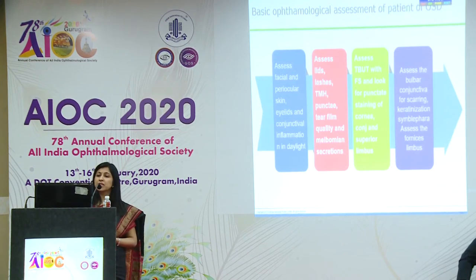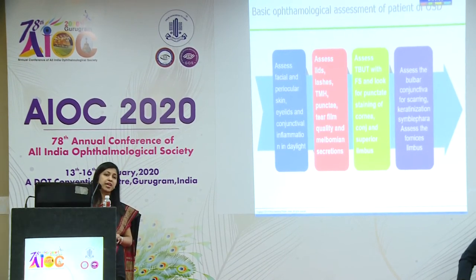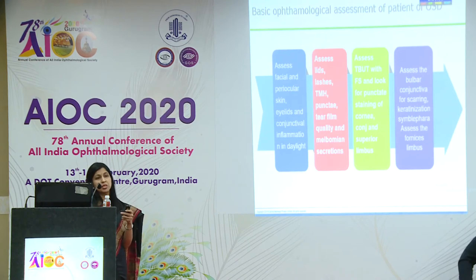So we have to understand what is the basic ophthalmological assessment, and it includes a proper assessment of the facial skin, the periocular skin. So you start doing a broad daylight exam without doing a slit lamp first, then go on to the slit lamp examination looking for every part: the lids, the lashes, the punctae, look at the meibomian secretions, the tear film quality, look at the tear film breakup time, punctate staining of the cornea, look at the bulbar conjunctiva, starting with look for any shortening of fornices, that would be the earlier signs that one would see. Look for keratinization, presence of symblepharon.